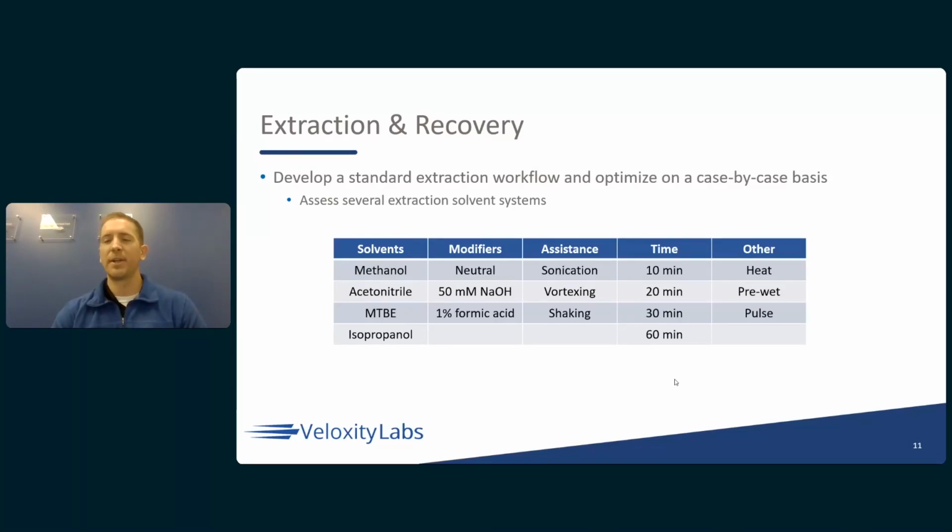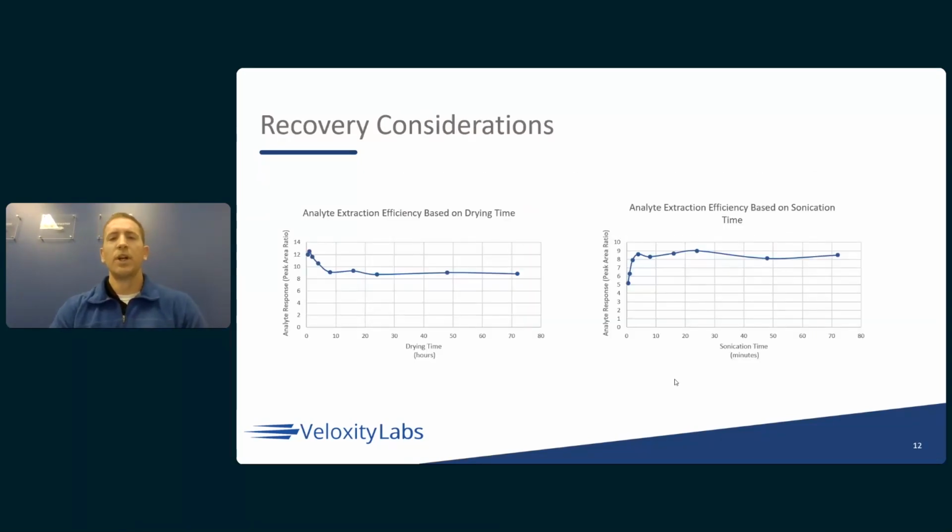Those blood samples are going to be dry. Some of them might even be crusty. So if you have a step where you just add a small amount of water to help pre-wet and then add your extraction solvent, if you're having difficulties, that's also another strategy too. So here's a plot of two experiments that we usually perform.